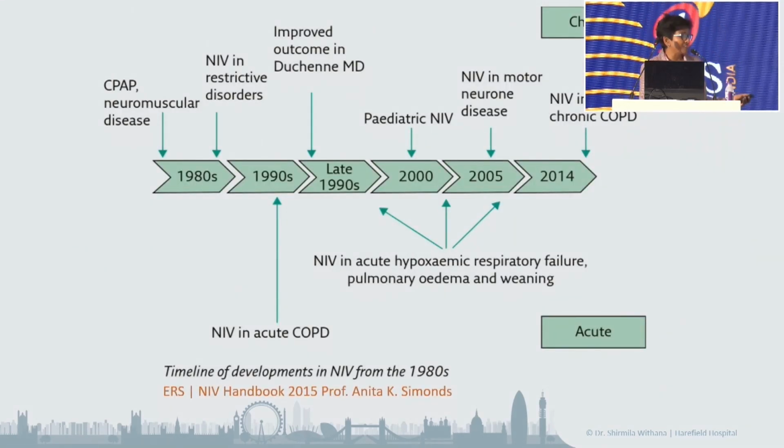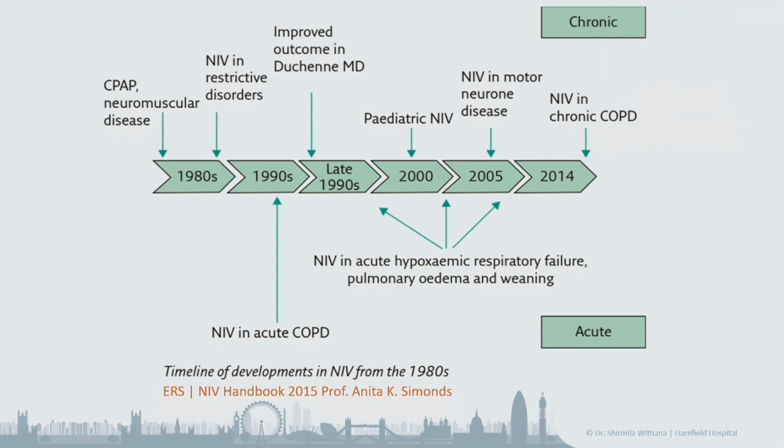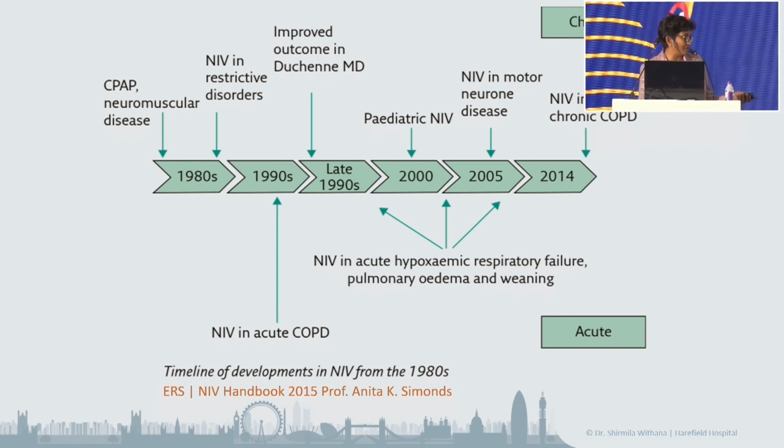This is the history and the evolution of non-invasive ventilation that I took from my guru, Professor Anita Simonds, recommended reading material. You can see non-invasive ventilation actually started with neuromuscular disease.